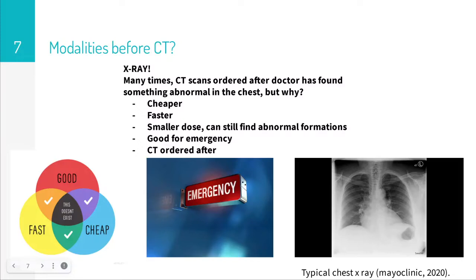When a patient is experiencing breathing difficulties, pain in the chest from injury, a fever, or a bad or persistent cough, an X-ray is the way to go. If there were no abnormalities or the X-ray was good enough, CT of course would then not be needed. But if an abnormality were to be found, then a CT would be done as it gives more details. For example, the chest X-ray may indicate an abnormality, but the CT will take that one step further and may show the location and nature of that abnormality.